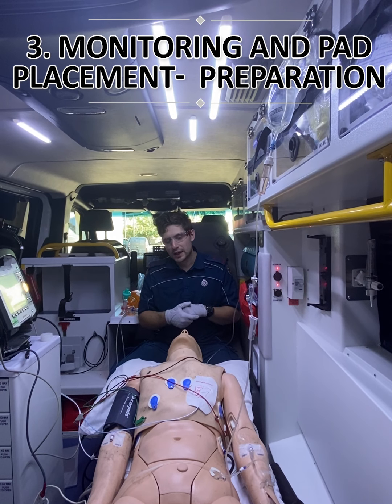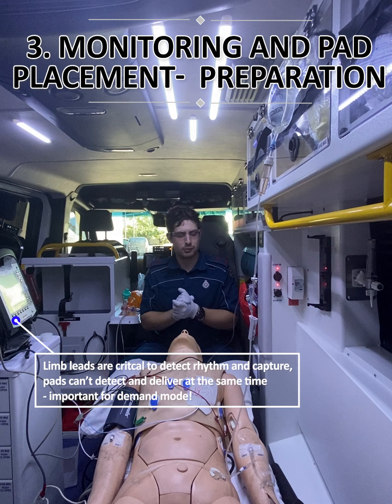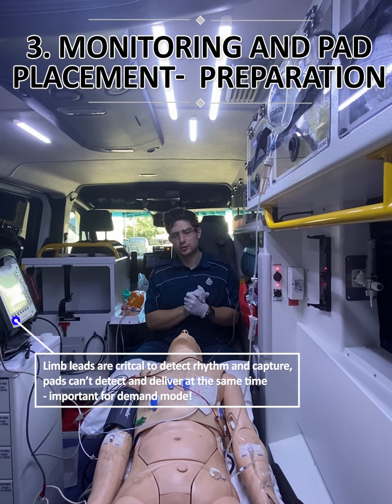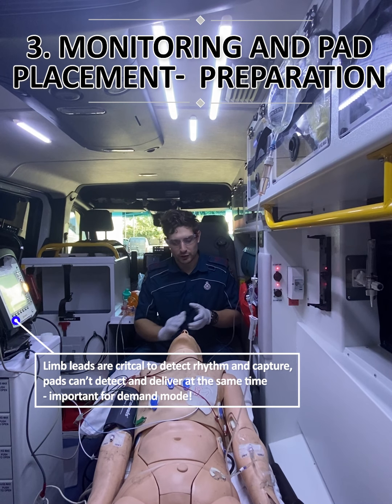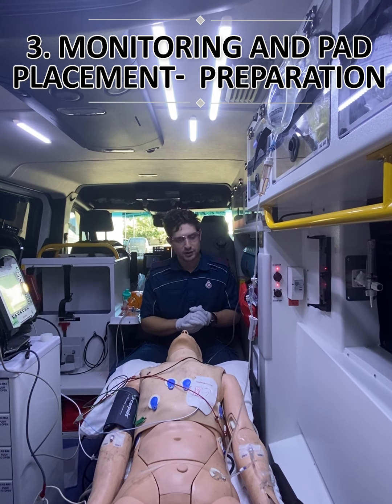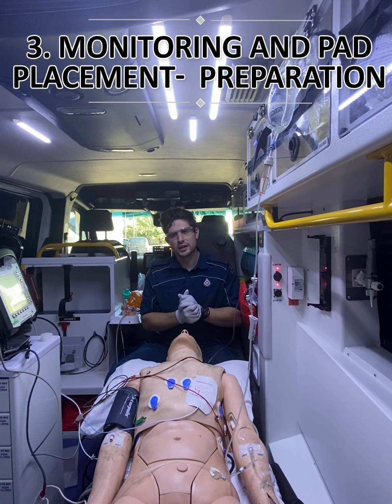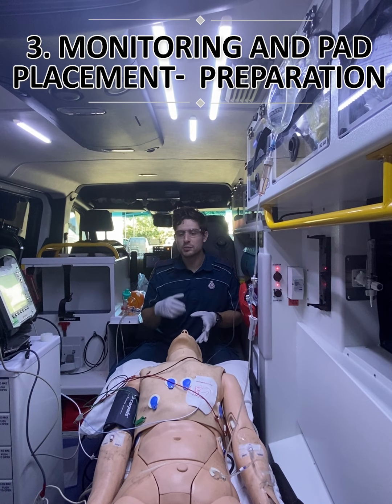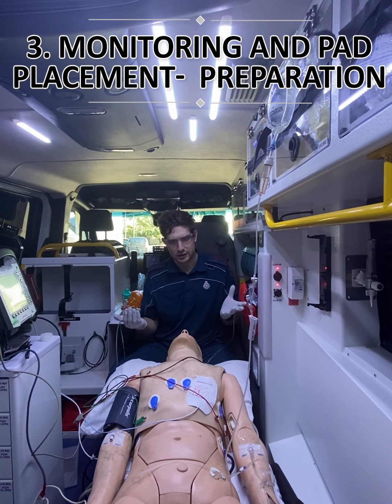As far as monitoring goes, we obviously need to have our ECGs on, our blood pressure being taken at regular intervals, not on the infusion line, and SpO2 attached as well to keep real-time monitoring of that pulse. We need to constantly be rechecking for a pulse, respiratory rate, conscious level status as well. We need to do a perfusion status assessment, respiratory status assessment, neurological status assessment. And that can often be offloaded probably to that circulation assistant if you are the single officer CCP.